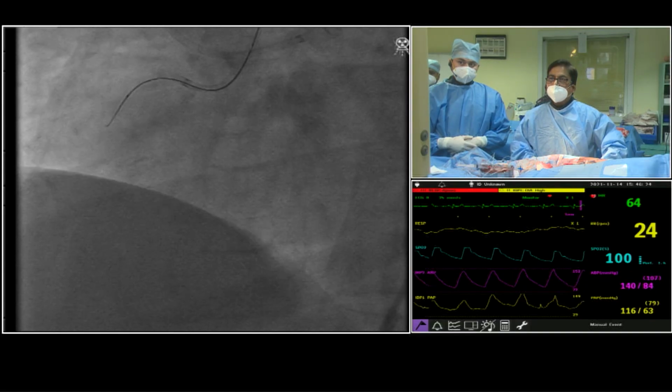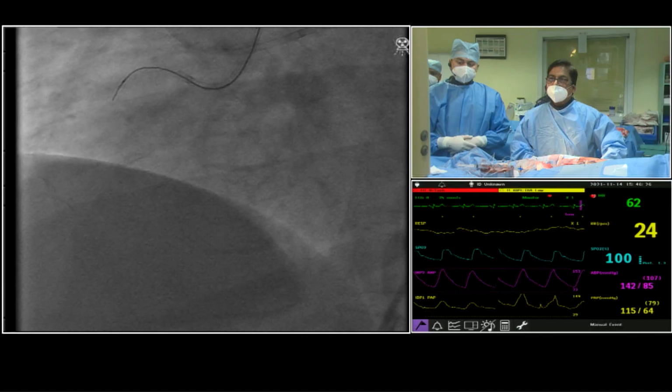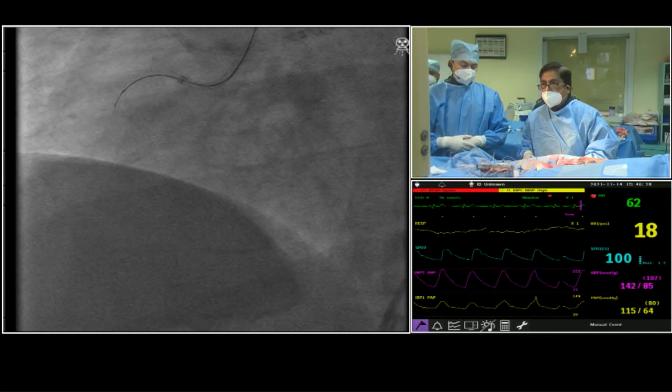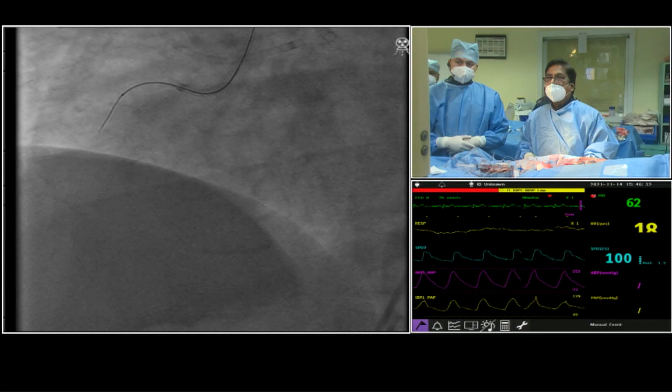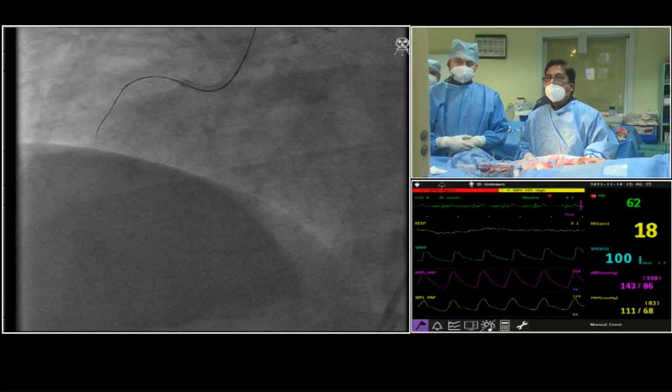So the transmission team, again, the same request. We have moved on to the speaker view on our devices, but we still see the same three frames. We really don't need to see all three frames, and the angiogram image is all that we need to see.